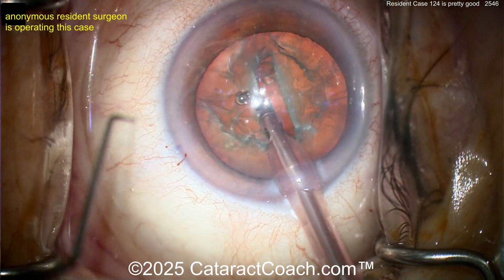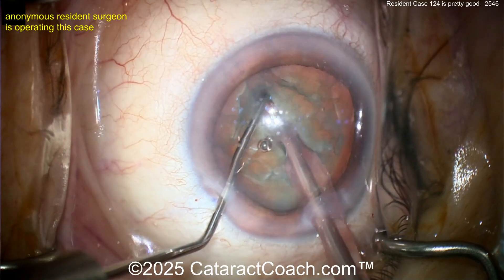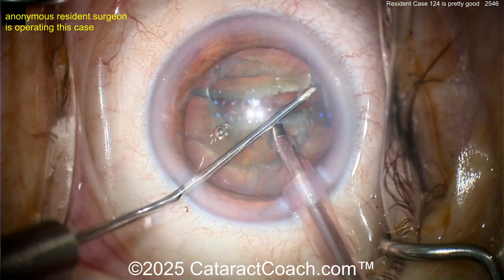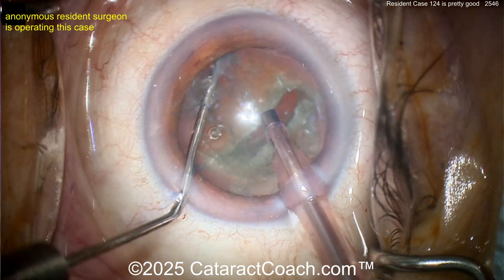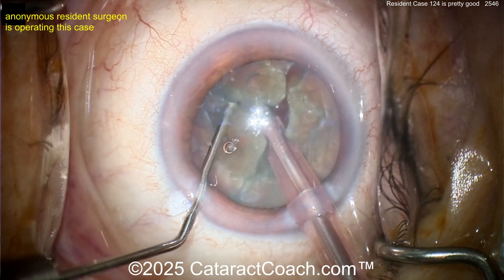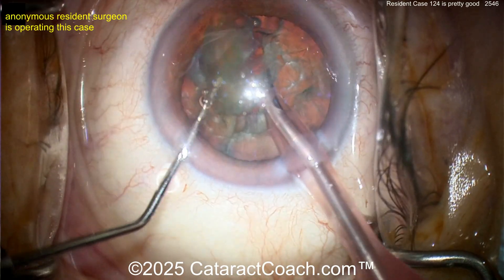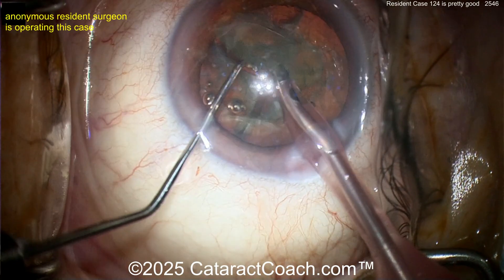Going in with the chopper as the second instrument. Phaco probe in the groove, chopper as well — now split it apart. Boom, nicely done. I like how you propagate it all the way through. This is a nucleus with a reasonable amount of density. Now that we have two halves, looks like we're going to do a chop — stop-and-chop, horizontal chop. Very nicely done. I'd actually get that quarter out first — it makes it easier. You can just aspirate it down with a little faco power. That gives you a lot more room in the bag.